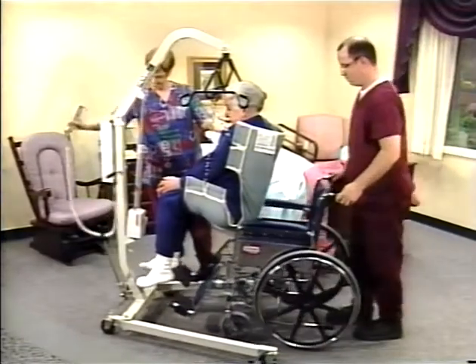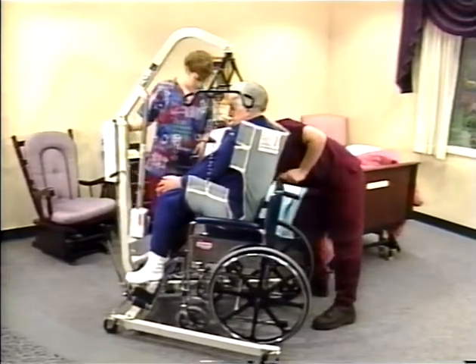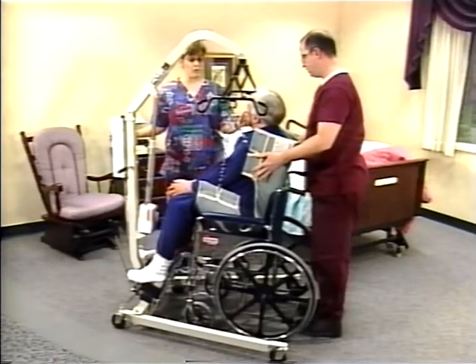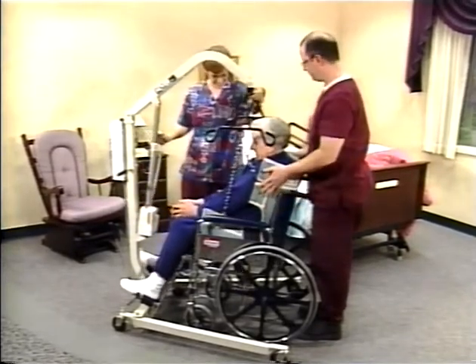When transferring to a wheelchair, always make sure the wheelchair wheels are secured. You need to know you can count on a secure place to seat your passenger. Position the sling over the chair. Slowly lower the sling and guide him into the chair.